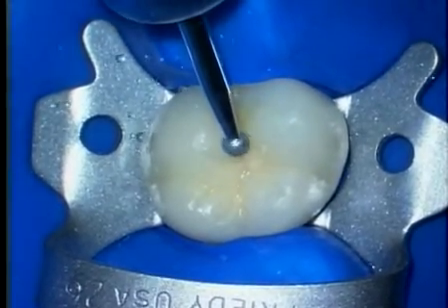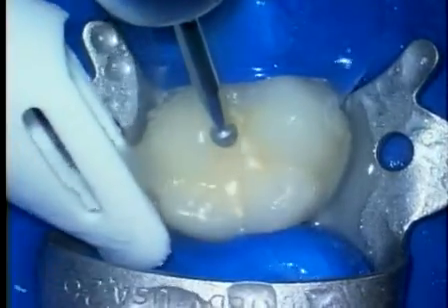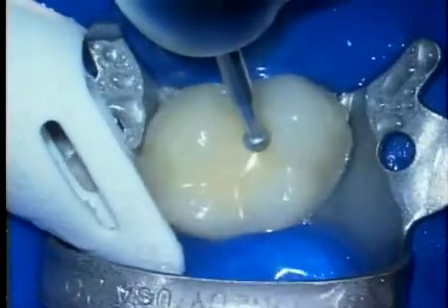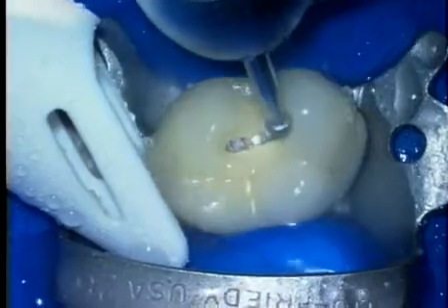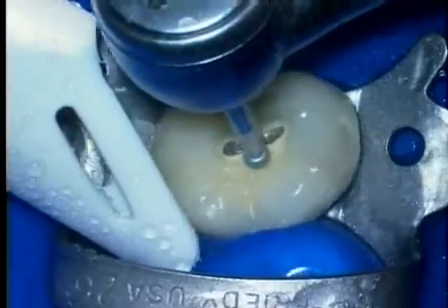The rotary cutting tool of choice is the round diamond burr. Voluminous amounts of water are used continuously as we begin to paint like a brush on the porcelain surface. Light brush cutting action eliminates the potential for fracture. As we paint with the diamond, we'll begin to see the underlying substructure.